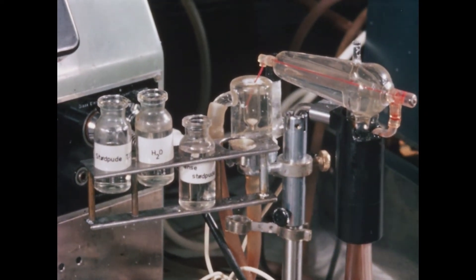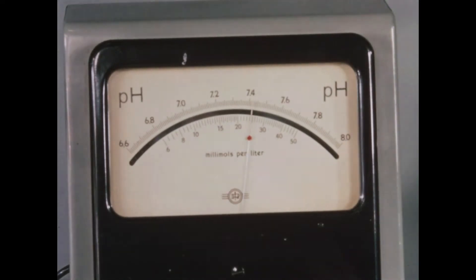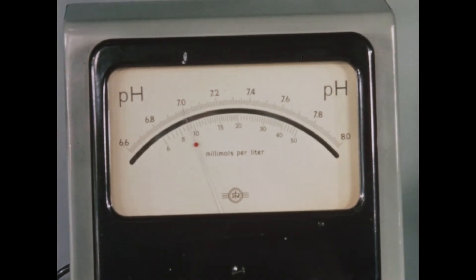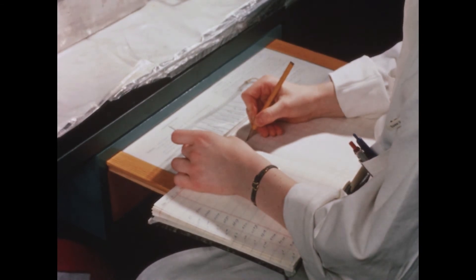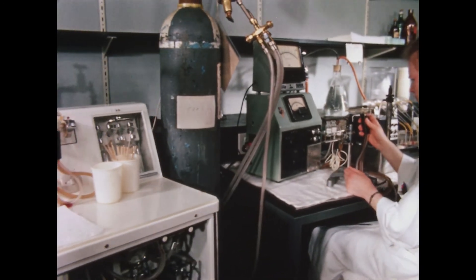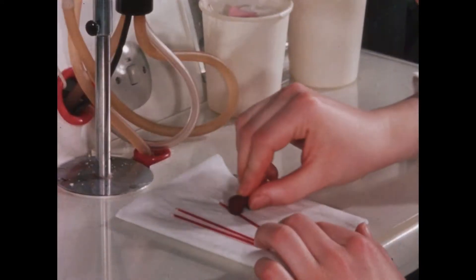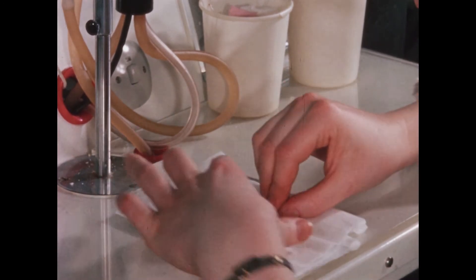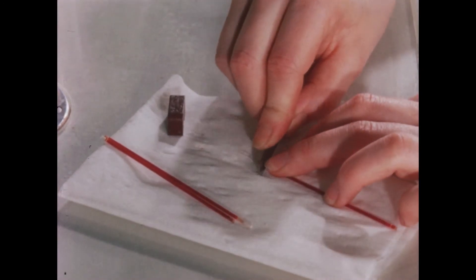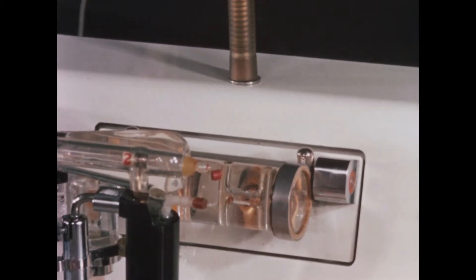In a modification of this method, microequipment is used, which permits the reading of the acid-base balance on capillary blood. The capillary blood is drawn into a glass tube containing heparin and stirred with a magnet and a small piece of iron wire in the tube. The ends of the glass tube are cut off. The blood is emptied into a special equilibration chamber through which a gas mixture is led while the chamber is shaken at a rate of about 2,500 times a minute, so that the blood whirls up along the sides of the chamber. Thereupon, the pH of the equilibrated blood is measured and the acid-base values may be calculated.